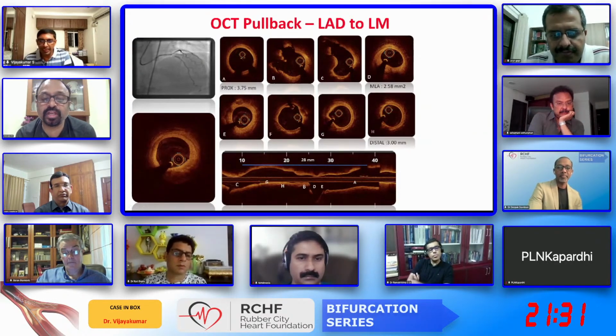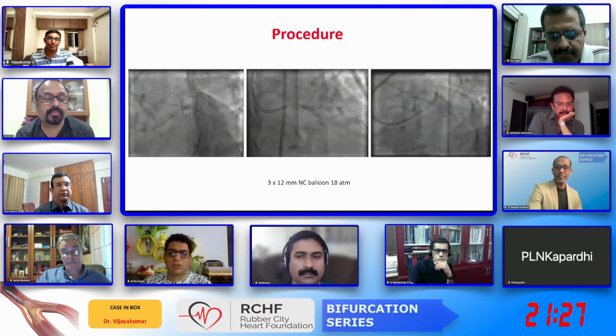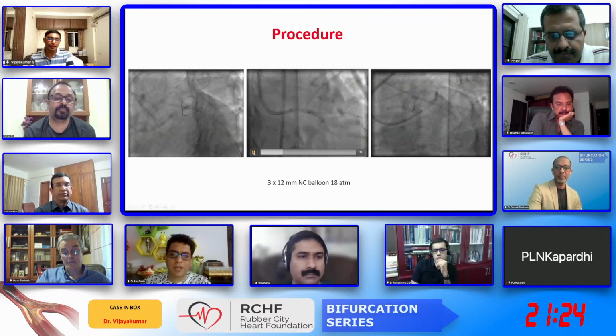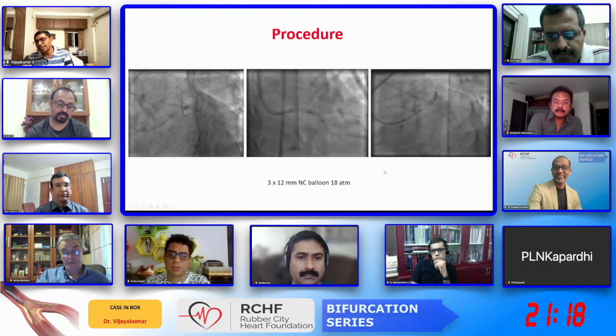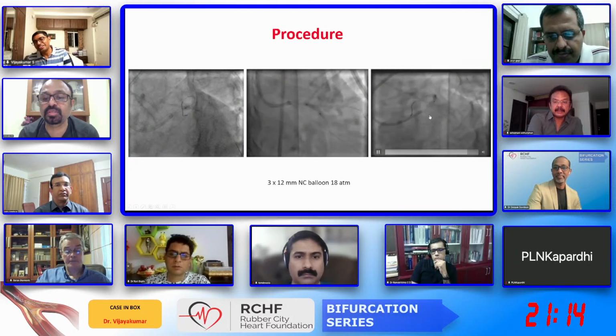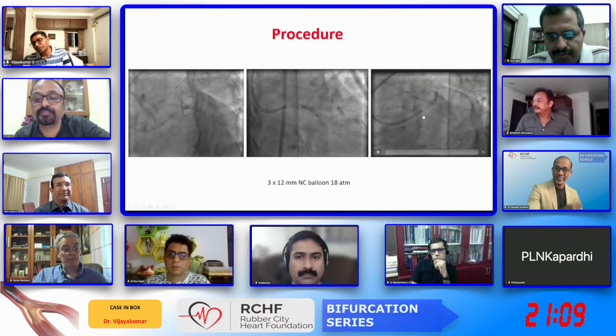So after preparing this one, Vijay, small question. Yes, sir. Did you have any OCT run of the LAD before? I'm just going to show next. No, I mean before the preparation. Before, no, we have not touched the LAD at all so far. You have the last image. Okay, this one. That OCT was done before this, and I'll just show you that.